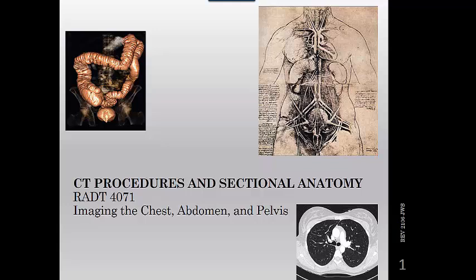The thorax has the highest intrinsic natural contrast of any body part. The pulmonary vessels and the ribs have significantly different attenuation values compared with the adjacent aerated lung. In most adults, the mediastinal vessels and the lymph nodes are surrounded by enough fat to be easily identified, but because of the intrinsic natural contrast, IV contrast is not necessary for all thoracic indications.